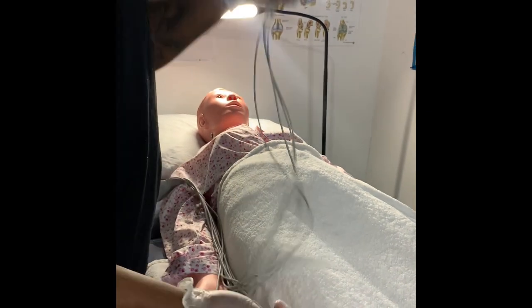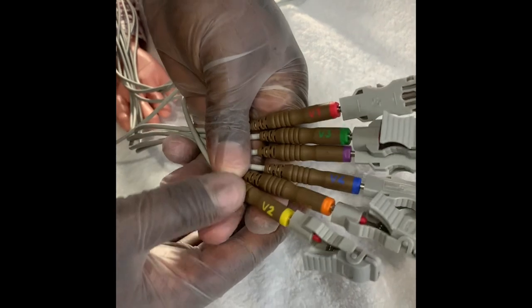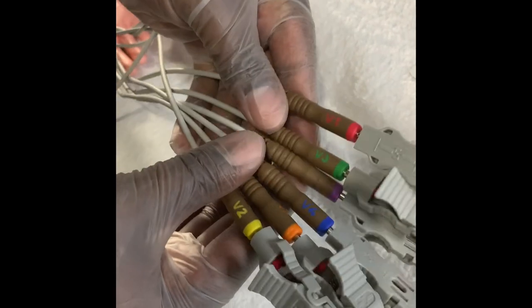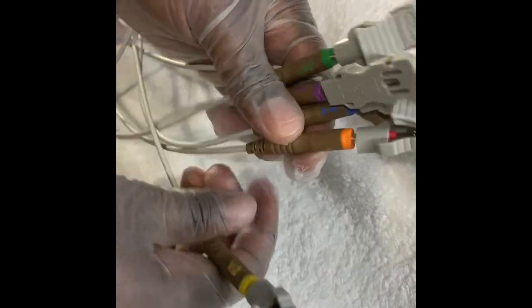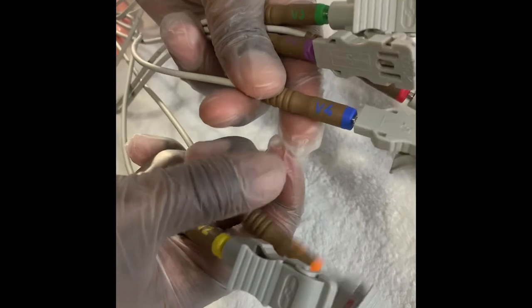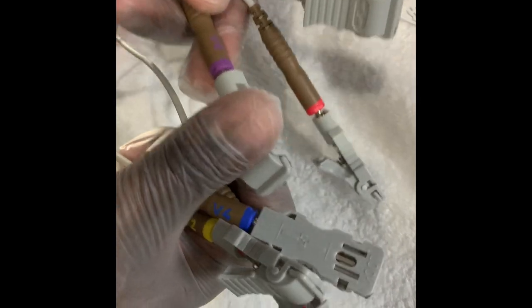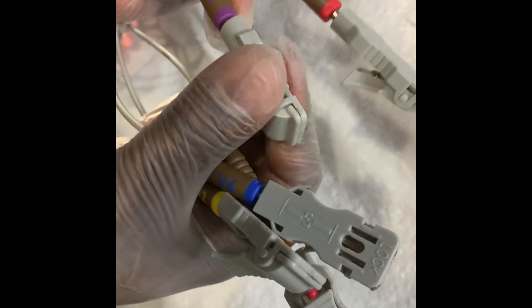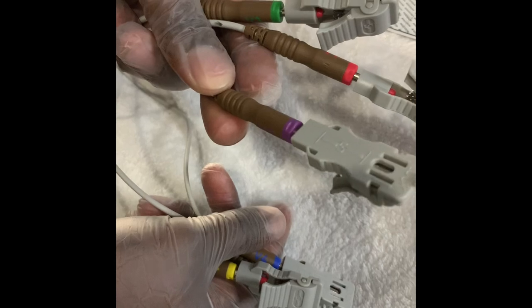Then you have the leads that you can go ahead and place on the patient's chest, starting from one to six. So this is V1, V2 is right here, and then they're labeled V5, V4. And this one right here is V6.